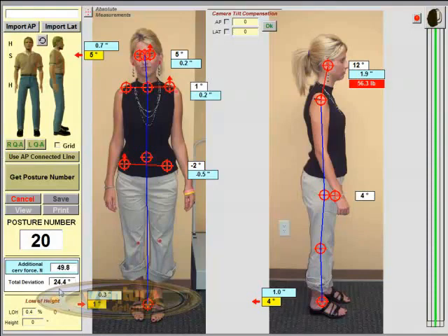So when you're explaining this to a client and it looks a little overwhelming, you simply say, Mrs. Smith, you see all these numbers. You know what all these numbers should be? They should be 0, which means no additional stresses on your body. And you can see on your screen we've got numbers all over the place. And our goal is to, over time, get these numbers back into a 0 or a neutral position, take that additional stress off your body, increase your flexibility.